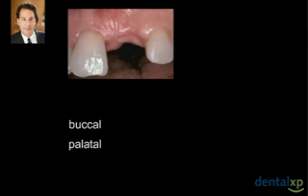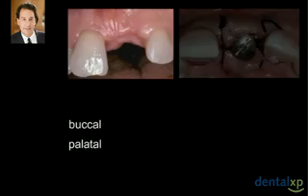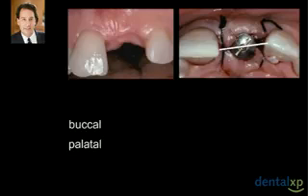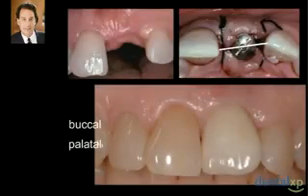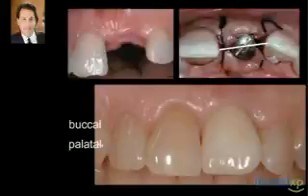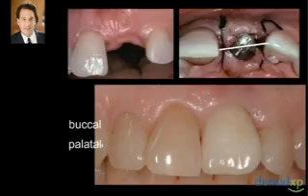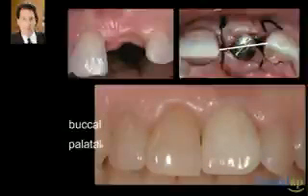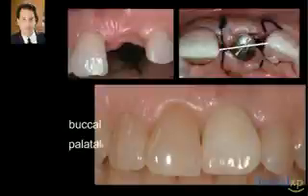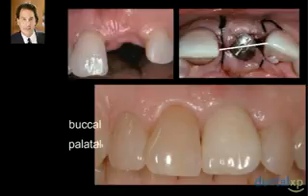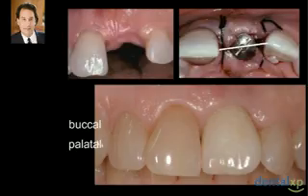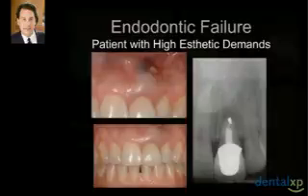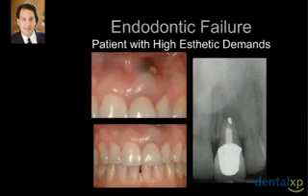This case, shown earlier from 1990, had the implant placed slightly to the palate. Here is a 15-year follow-up of that same patient — notice there is no recession at 15 years on the implant in the area of tooth number 9. This is due primarily to bone volume and the patient's biotype. When implants are placed too far labial, there is a good chance of developing recession.